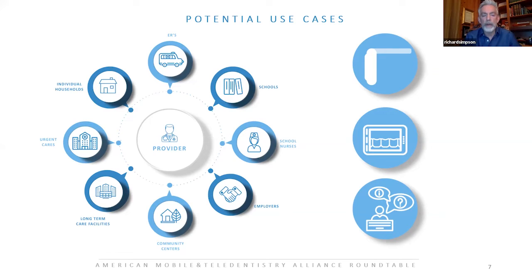And so being able to manage oral conditions for intensive care patients or patients in step-down facilities and in skilled nursing facilities can significantly reduce costs by improving their health, being able to address needs where they are, and then direct and target your care appropriately, as opposed to having to load patients up into the ambulances to get them out of the skilled nursing facilities to the dental office. So there's some more real world experiences that we are seeing, and we see such great potential nationwide. Thanks, Daniel.